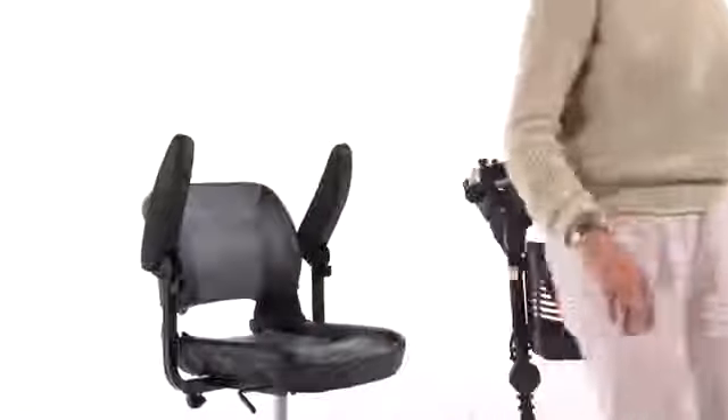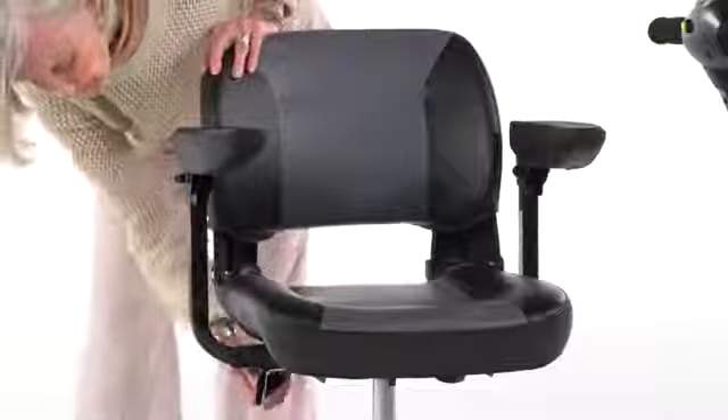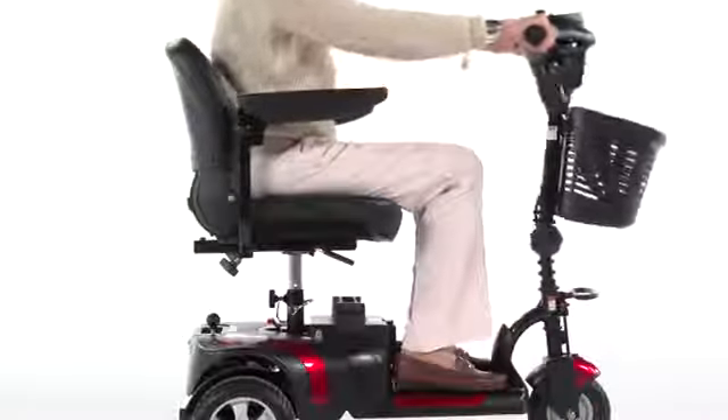The padded armrests are contoured for comfort and flip up for convenient boarding and exiting of the scooter. The armrest width can be adjusted to best fit the user, plus the tiller's angle is adjustable to position the controls in the most comfortable driving position.